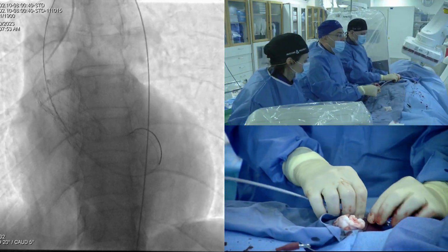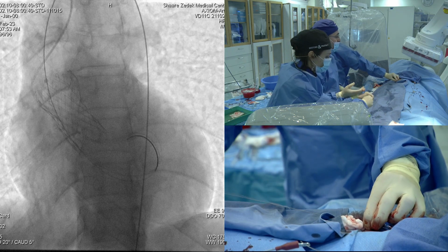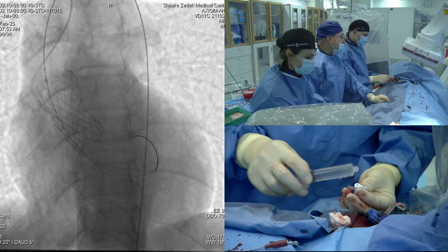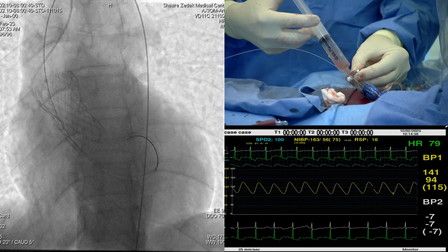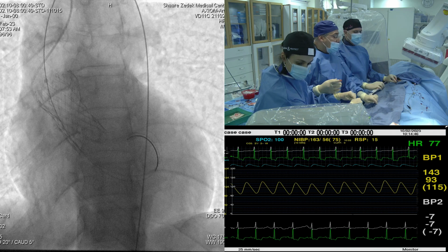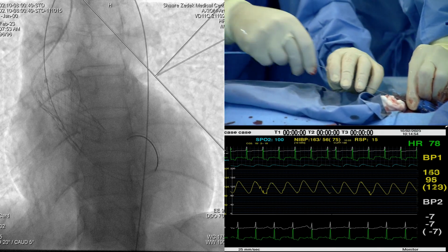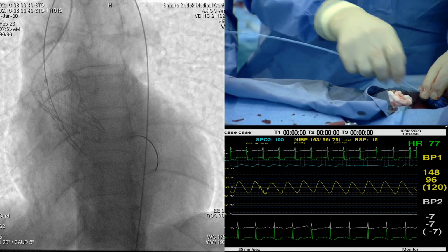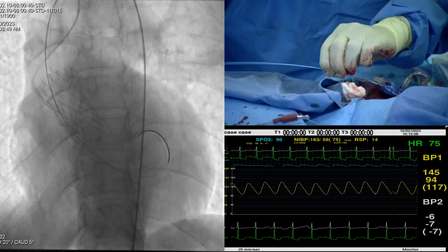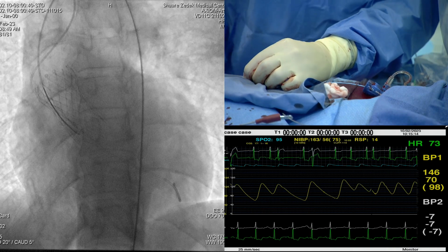It's also a very important, great question. So gradients, we rarely have gradients in conventional TAVI, non-valve-in-valve cases. And we can check gradients in the room also. AR, in almost all situations, we understand by the hemodynamics and by aortograms. The only added thing that is clearly an echo thing is pericardial effusion. Except for pericardial effusion, and borderline situations, whether to post-dilate or not, if you're not sure from the hemodynamics or aortogram, I don't see the benefit of having echo routinely during these cases. So more and more we do not really utilize it.